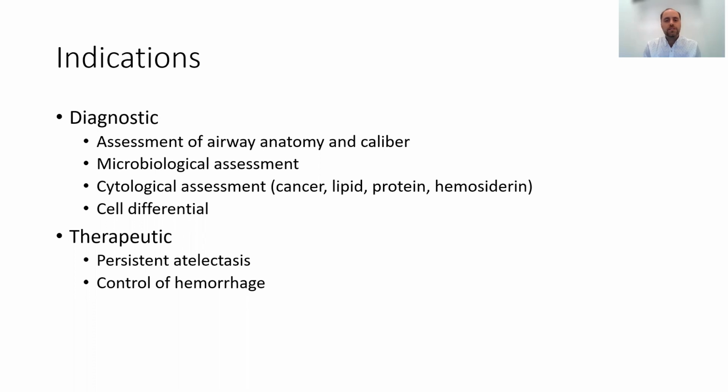A flexible bronchoscopy is typically performed for both diagnostic and therapeutic purposes. Diagnostically, it helps to assess the airway anatomy and caliber. It allows for a microbiological assessment to see which bacteria, fungus, molds, or non-tuberculous mycobacteria are living in the airways.